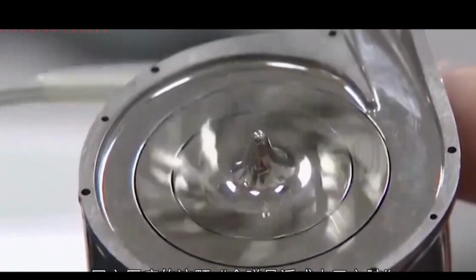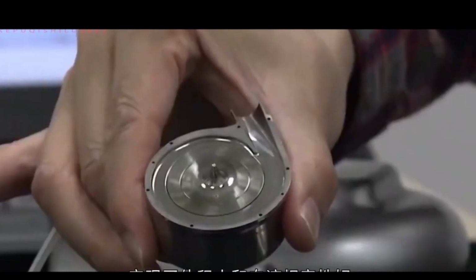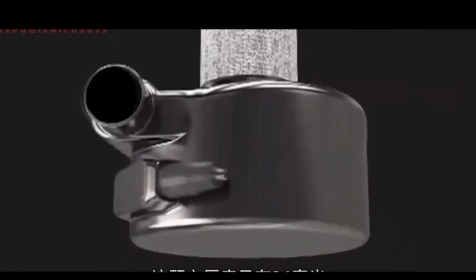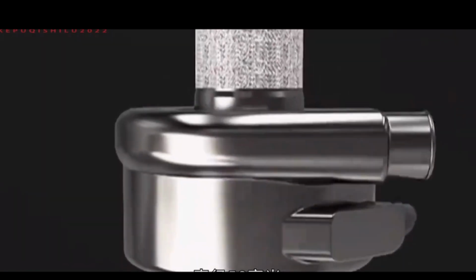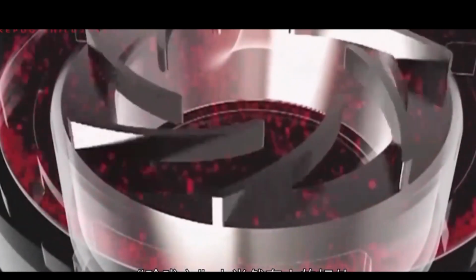The 1-year survival rate of artificial heart implantation treatment is about 90%, and the 3-year survival rate is 82%-84%. At present, the equipment cost is 1 million yuan, and the surgical cost is 200,000 yuan. After the surgery, Ms. Pan was transferred from the ICU to the general ward on the 5th day. After 12 days, Ms. Pan's various indicators met the discharge requirements and she was discharged smoothly.